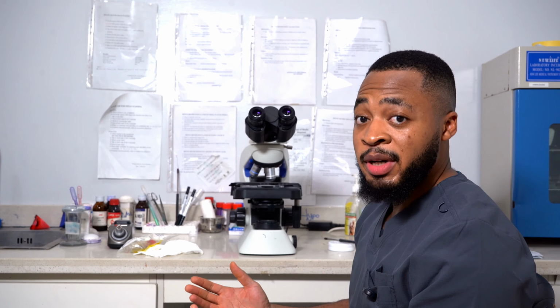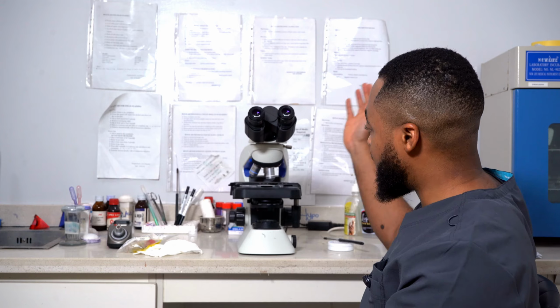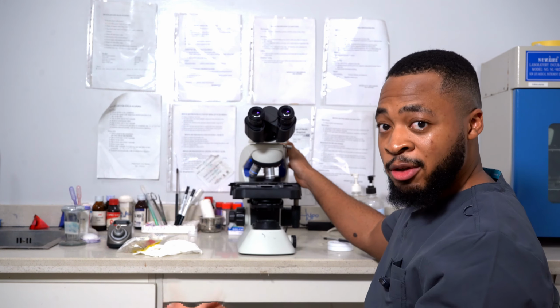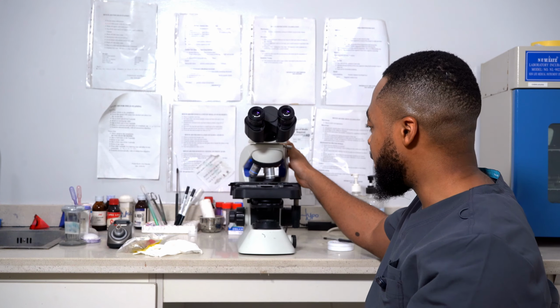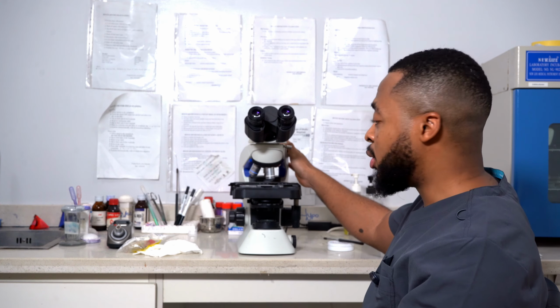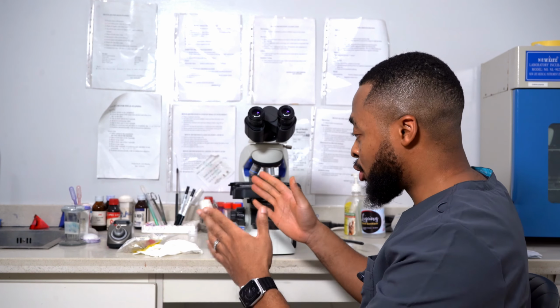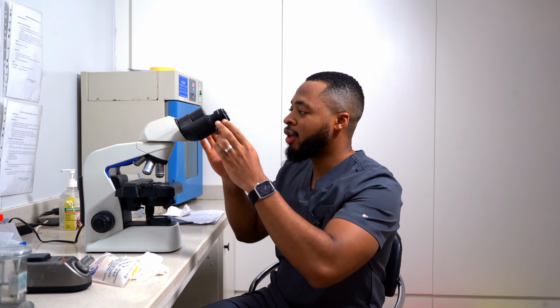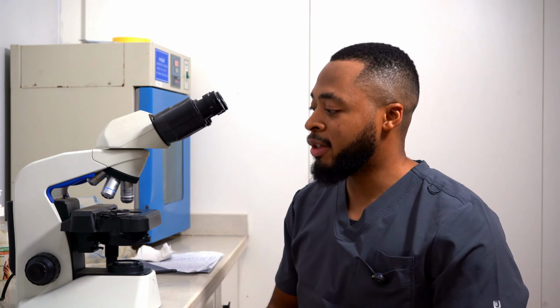The next step is microscopy, which is what we use this for. So the M in MCS is the microscopy that I'm about to explain. So in this step, we look at the stool sample. It goes through some processes which I can't show you now for clear reasons. So we observe the stool sample under the microscope and observe for things that cannot be seen with the eye. Things like parasites, things like bacteria that could contribute to the symptoms you may be having and the discomfort you may have in your belly.